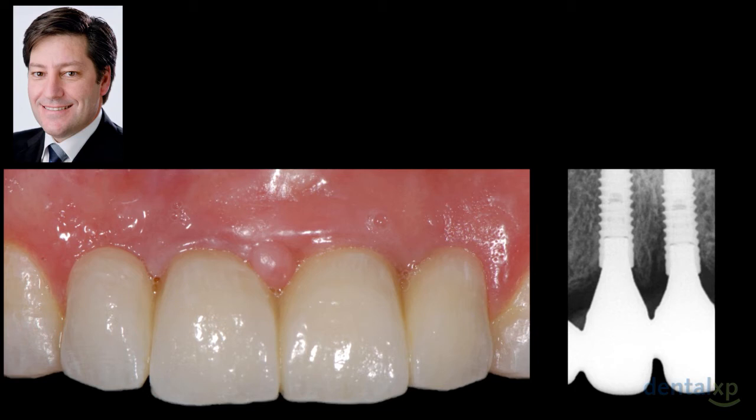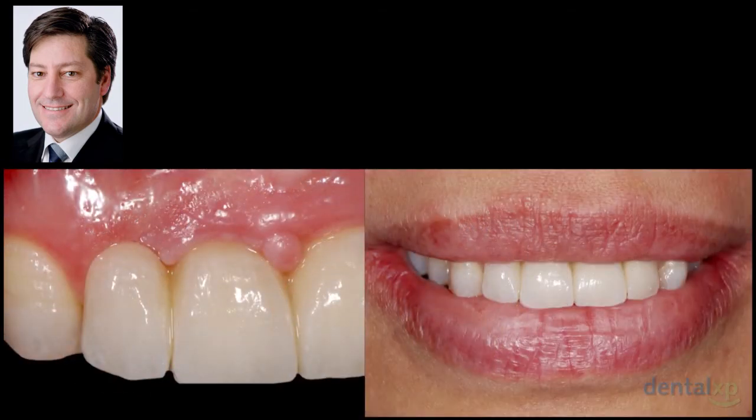and I will show you a trick here. You need to, again, pay attention with your eyes. If you look at the embrasures, these embrasures are slightly more saturated than they should be in terms of the ceramic veneering. Patients normally don't like that. They say, oh, my teeth look a little bit brown in between. But when you put the lip back, you see what this does. This creates an illusion that some sort of a tip of a papilla is coming down.